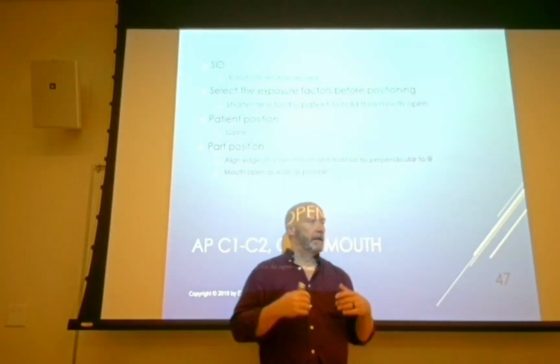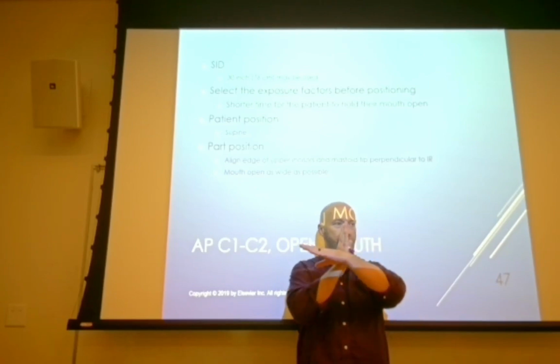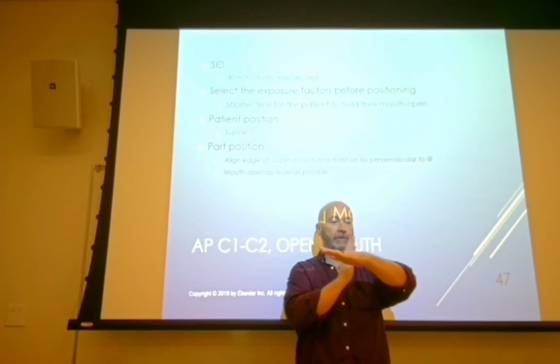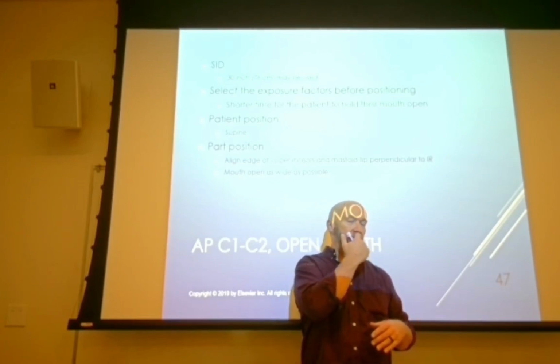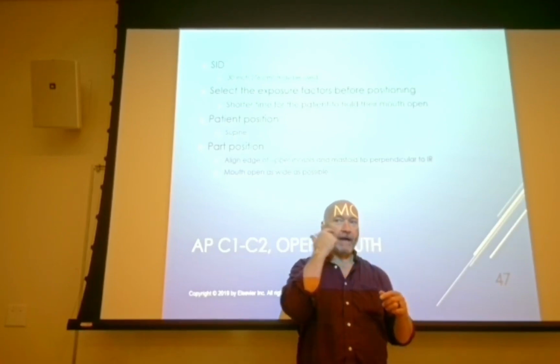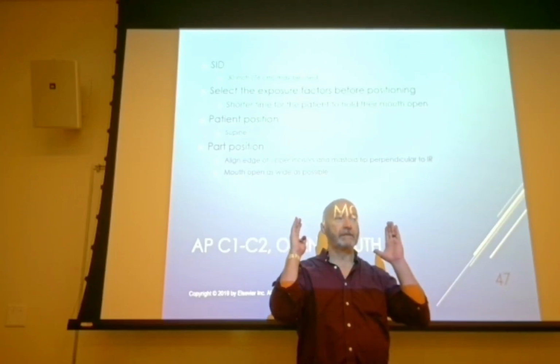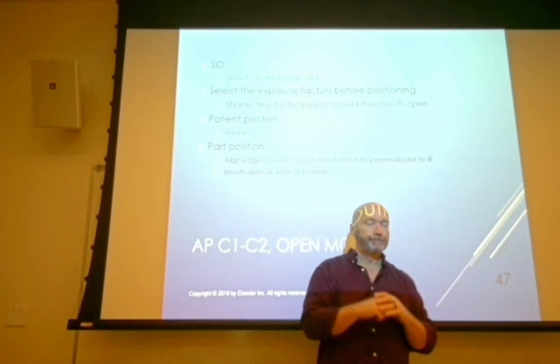All right, so if it helps, you've got those two lines on your collimator, right? So you've got crosshairs. That's what we refer to that as. So if you put the crosshairs right on the acanthion and open your collimators until that light of collimation is out as big as the head, then you can flex and extend the chin until you get that acanthomeatal line perpendicular, right?